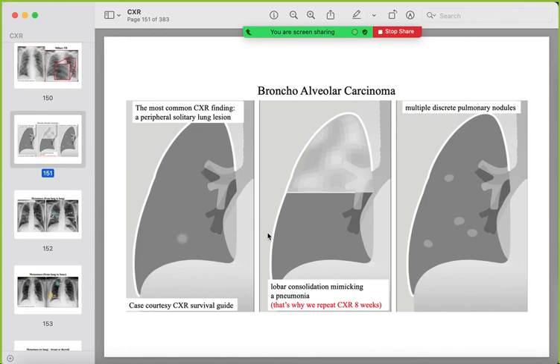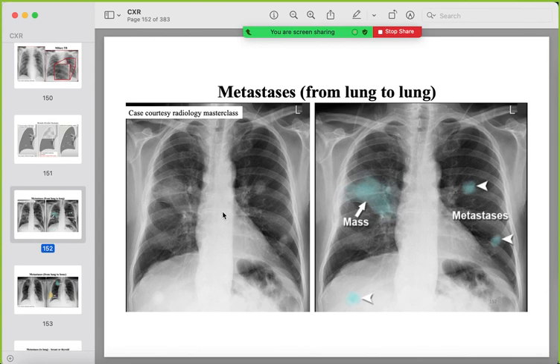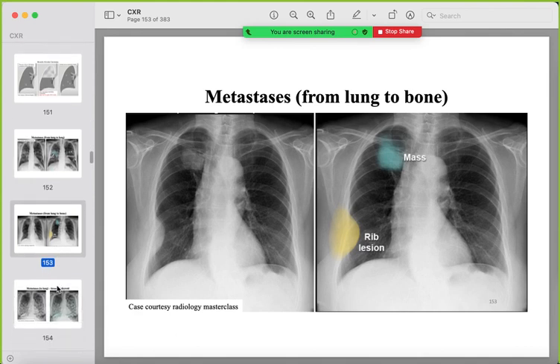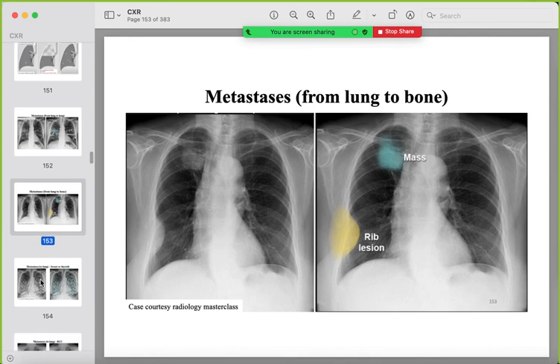An important entity is bronchoalveolar carcinoma — this is why we request a repeat chest X-ray six to eight weeks after pneumonia. Bronchoalveolar carcinoma will not completely resolve with antibiotics. It can present as a solitary nodule, consolidation-like opacification, or multiple nodules. Example of lung metastasis: one nodule visible under the diaphragm and the primary lung tumor is also shown. Another example of lung-to-bone metastasis with rib destruction — the primary tumor could be the lung lesion visible on imaging.